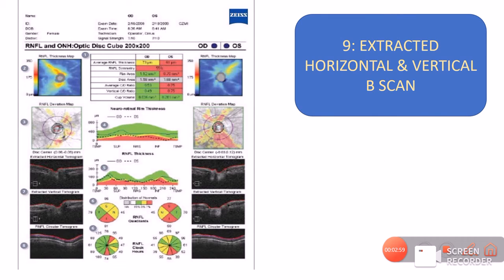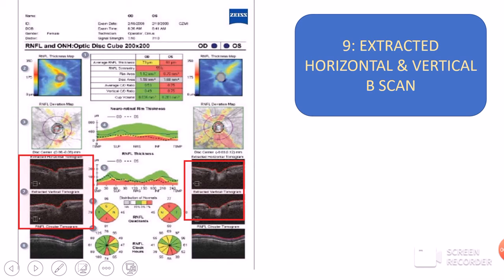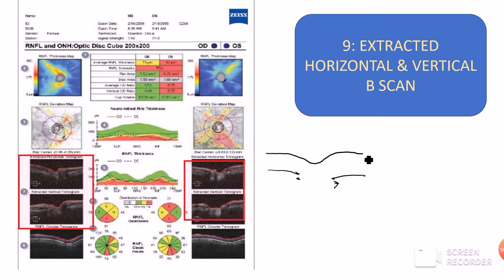The ninth component is the extracted horizontal and vertical B-scans. The machine performs B-scans to locate the boundary of the cup and the disc by determining where the retinal pigment epithelium ends, or where the Bruch's membrane ends — taken as the boundary of the disc — and from there calculates where exactly the internal limiting membrane is. For correct localization, the machine performs B-scans both in the vertical and horizontal directions of the disc.